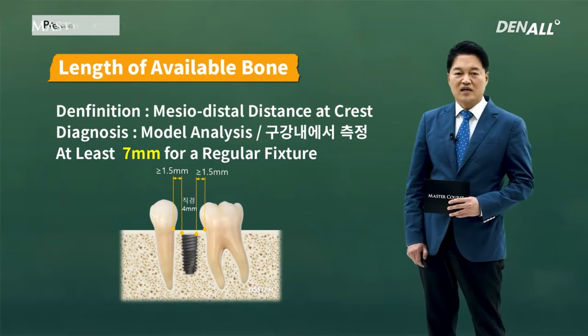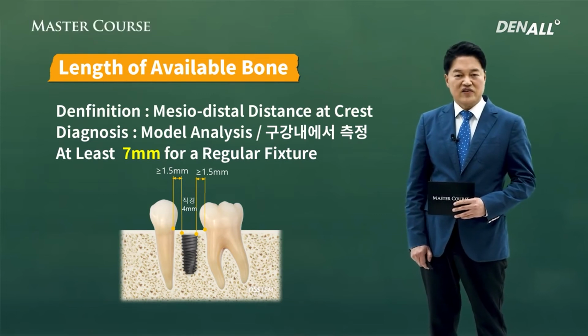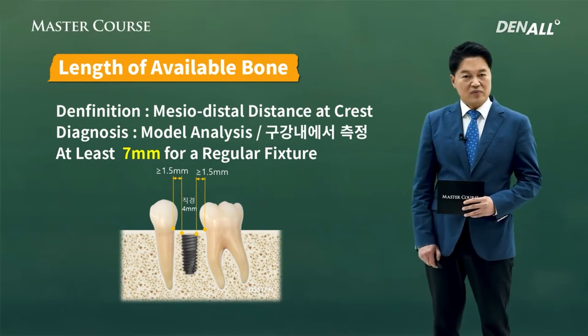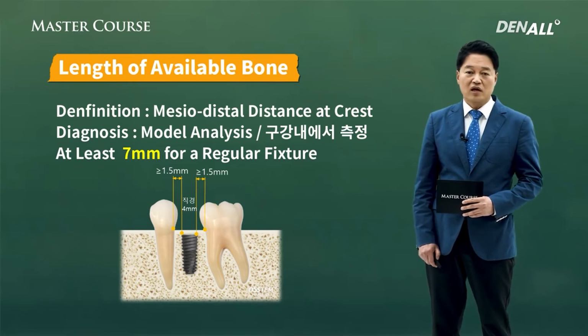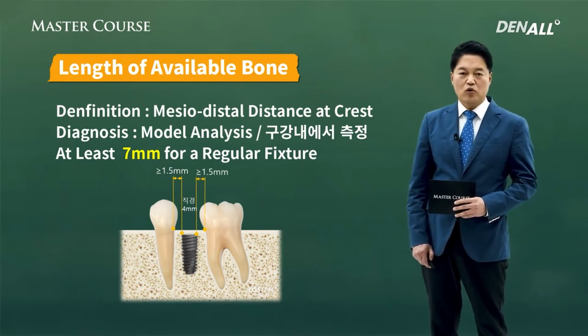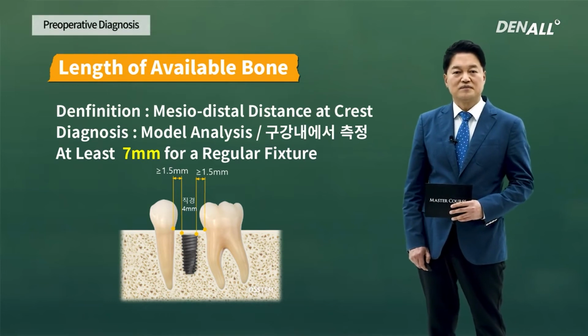If you are going to place a 4 millimeter diameter fixture on both sides, you need 1.5 millimeter on each side. So a total of 7 millimeter of mesiodistal distance is required. If you're going to place a diameter 5 millimeter implant, the mesiodistal distance needs to be at least 8 millimeter.